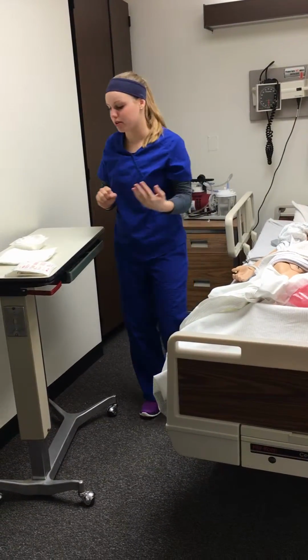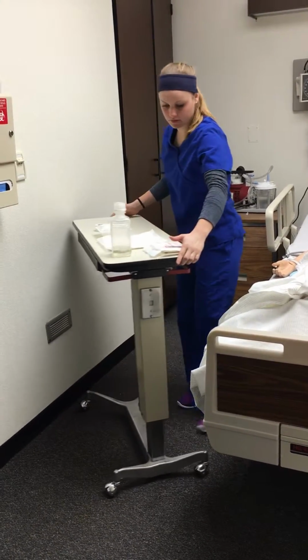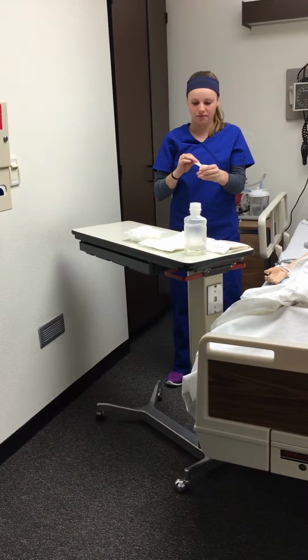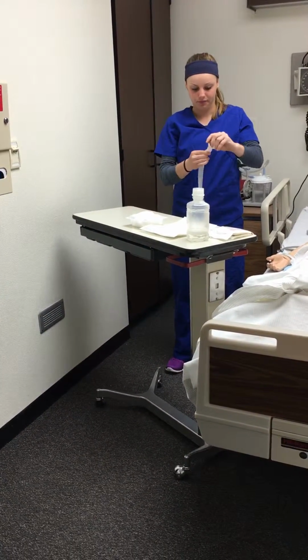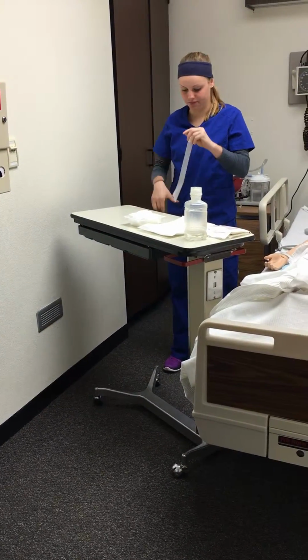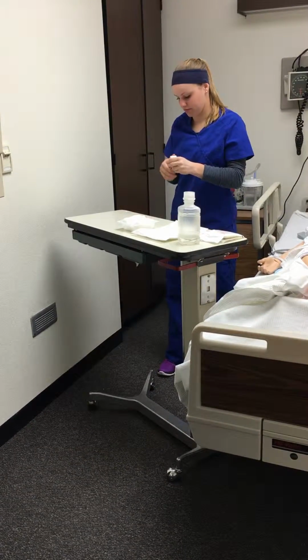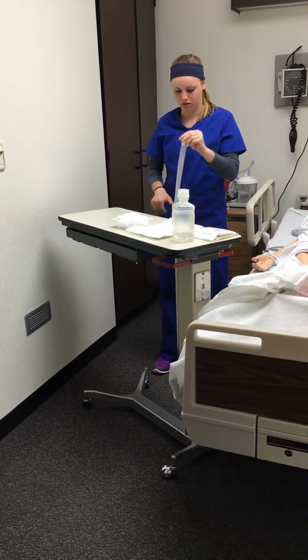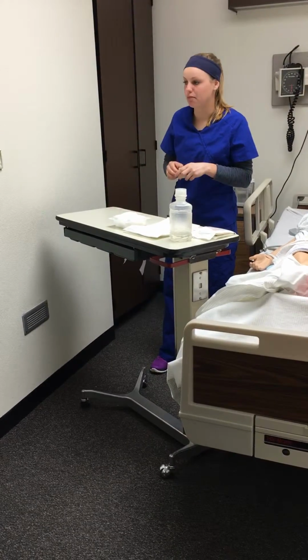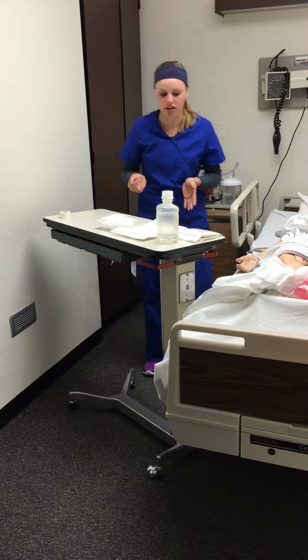Before that, I need to establish a sterile field, so this is my clean countertop. I'm going to get my tape ready before I'm all gloved up, because it's easier to rip right now. If the tape was contaminated, we would do hand hygiene again before putting the sterile gloves on.